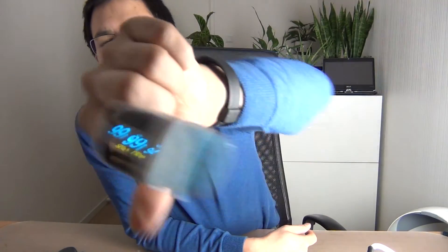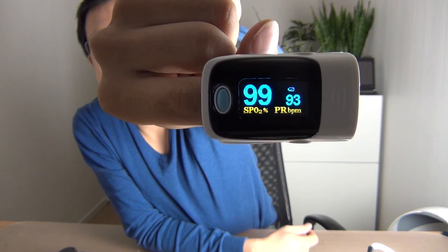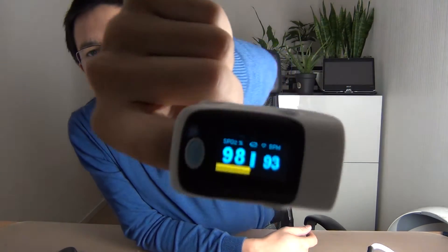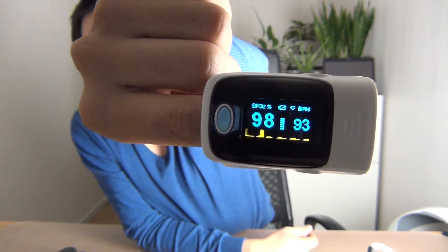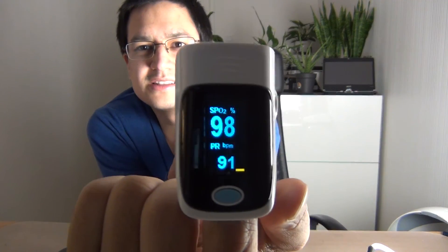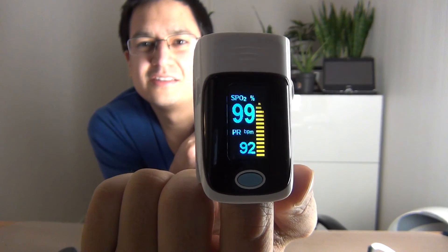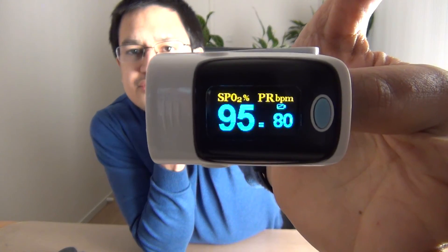So here's this information, and if I press it again it just flips the screen so the information is now shown in a different orientation. If I press it one more time it shows another screen — all with the same information but just a different display. And here we are back on the same view I showed you before.